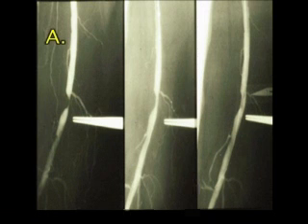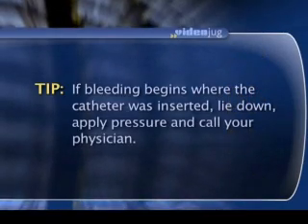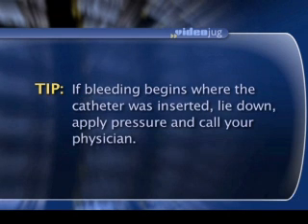What can frequently be expected to result from a successfully performed balloon angioplasty and stenting is restoration of the blood flow to the body part that was affected by the narrowed or blocked blood vessel. What can I expect after angioplasty and vascular stenting? The recovery time that's required for angioplasty and stenting is usually bed rest for 1 day. We also recommend that the patients take it easy in gradually restoring their normal activity.